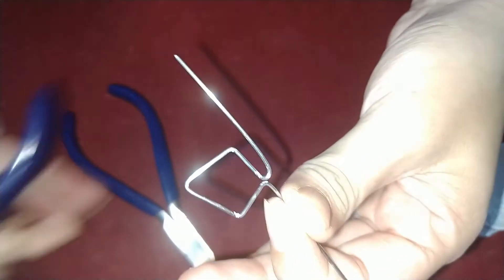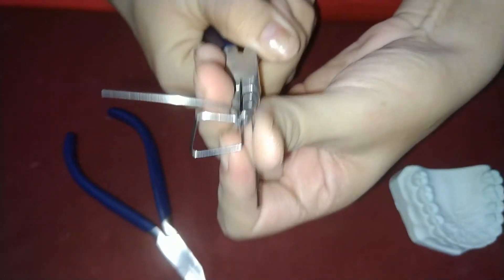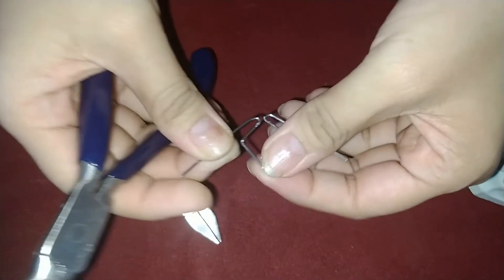We will be doing the same types of bends on the other side. This is how the diamond should look like.